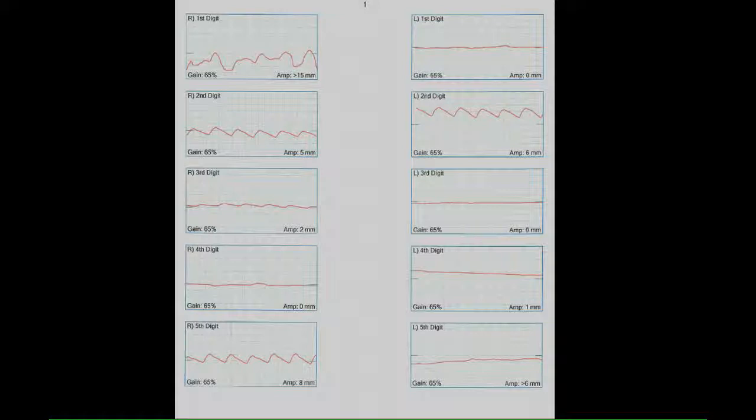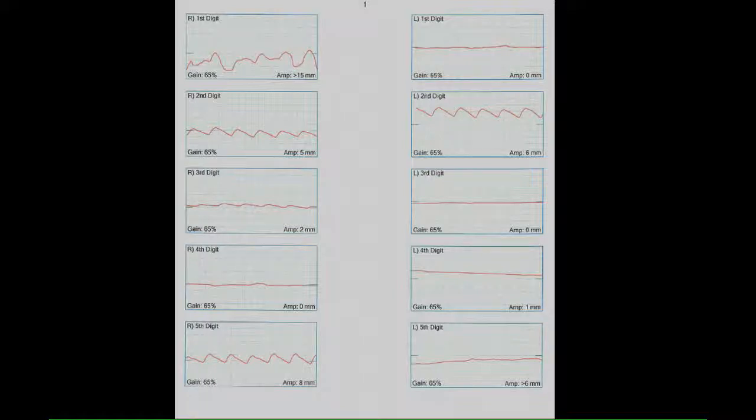However, after cold immersion, we note a significant decrease in flow at all levels, most notably at the left first digit, bilateral third and fourth digits, as well as the left fifth digit.